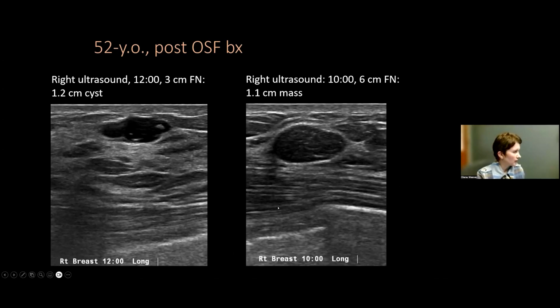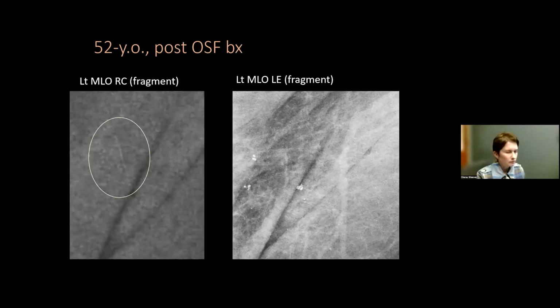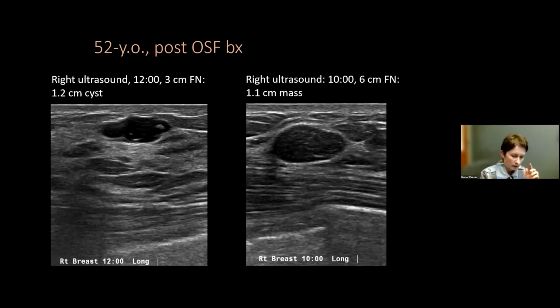It's so circumscribed and looks very benign on ultrasound and non-enhancing. So the chances are that this is just a benign fibroadenoma. It just so happened that this woman had a prior ultrasound, so it was a stable benign fibroadenoma. So it's a true negative contrast enhanced mammogram, specifically a true negative recombined mammogram for a benign mass.